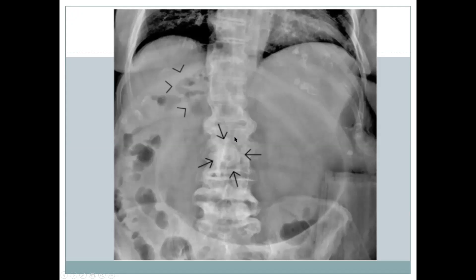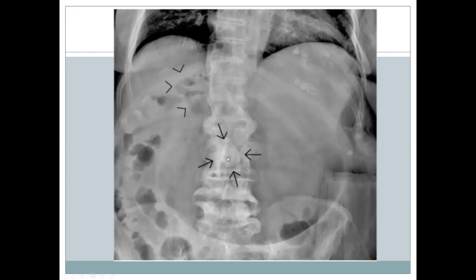This is a supine X-ray of the abdomen. There is some radiolucency in the right hypochondrium — this is actually air in the biliary tract, known as pneumobilia. There is also a radiodense rounded opacity superimposed on the lumbar spine, which is the migrated gallstone. There is a really distended stomach because the gallstone migrated from the gallbladder into the duodenal bulb, resulting in gastric outlet obstruction. You can see all three signs of Rigler's triad here: the gallstone, the dilated loop, and pneumobilia.